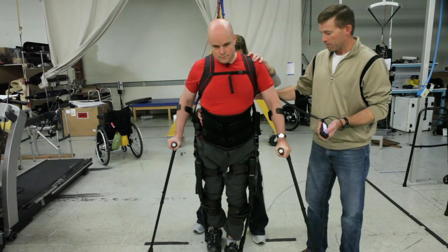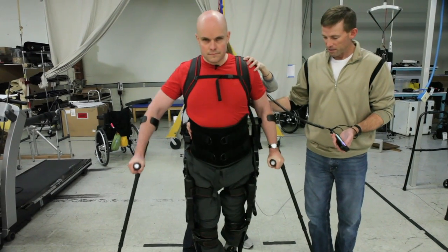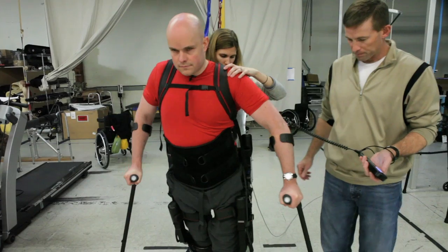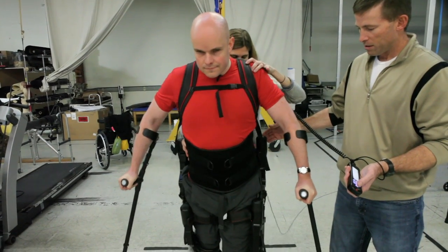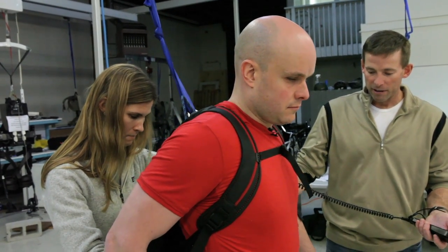Shift your left. Come to me, hair forward and step. Good boy. Push your right. Push to your left. Then come forward. Push to your left and forward. That looks good on the left right.